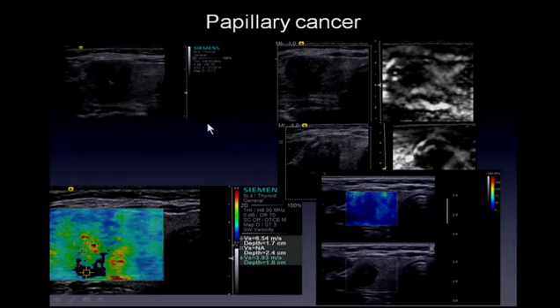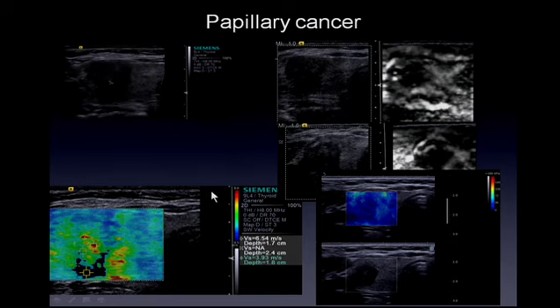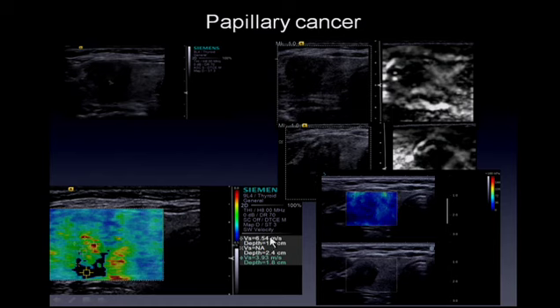This is a papillary cancer case from our lab. On B-mode imaging you can see a couple of calcifications. Strain elastography shows that this portion of the lesion is very hard while normal thyroid is soft. On shear wave imaging from a Siemens system and a supersonic system, we have higher velocities, with some areas as high as 6.5 meters per second, and on the kilopascal scale some areas of high signal surrounding the lesion.